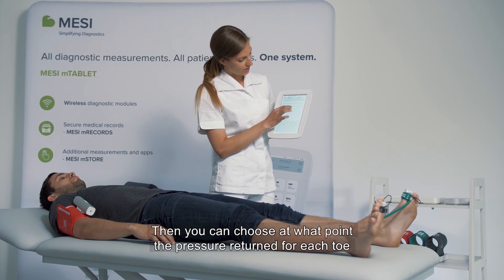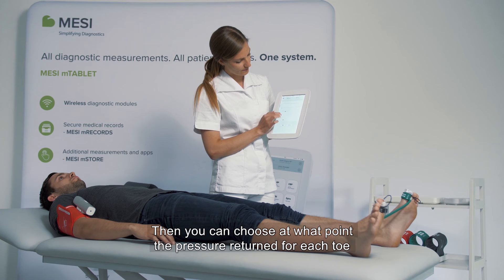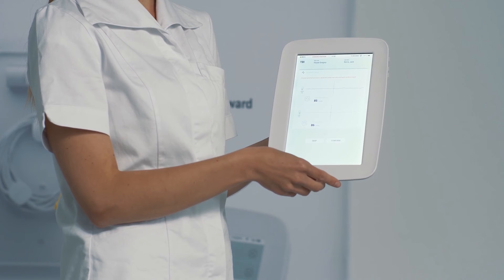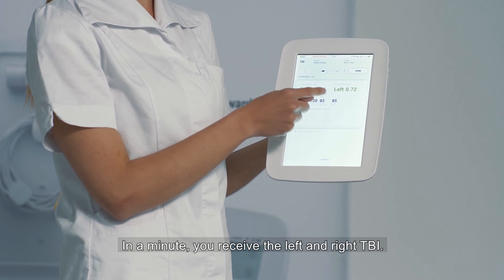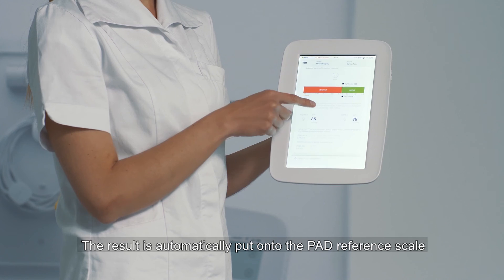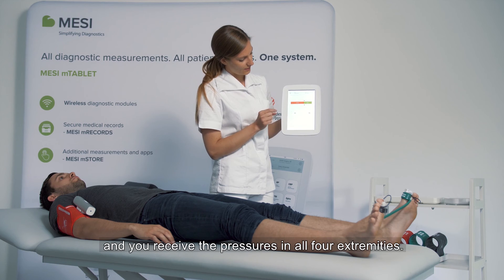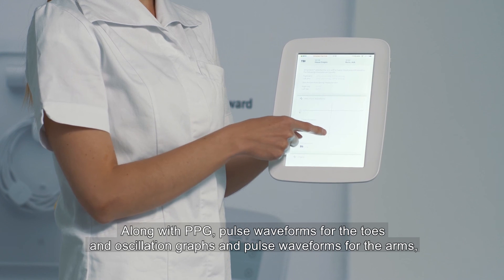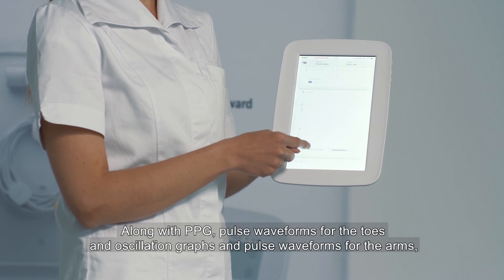Then you can choose at what point the pressure returned for each toe and you confirm. In a minute, you receive the left and right TBI, so toe brachial index. The result is automatically put onto the PAD reference scale and you receive the pressures in all four extremities along with PPG pulse waveforms for the toes and oscillation graphs and pulse waveforms for the arms.